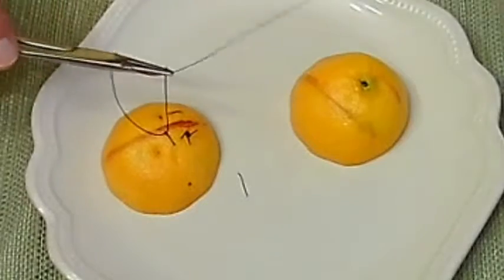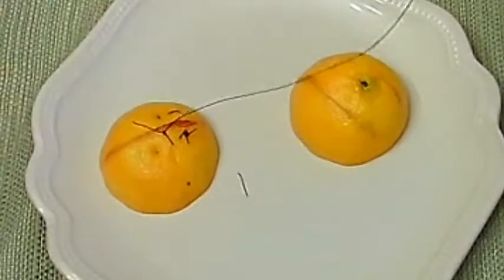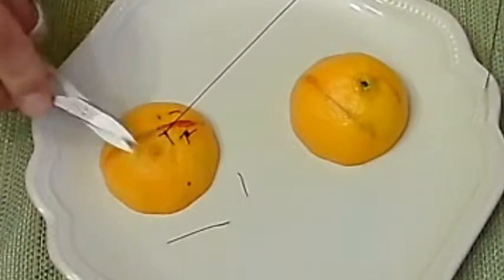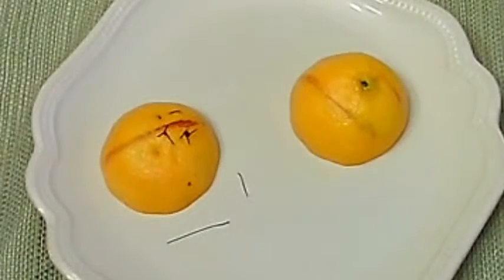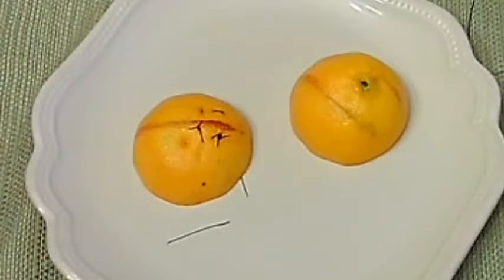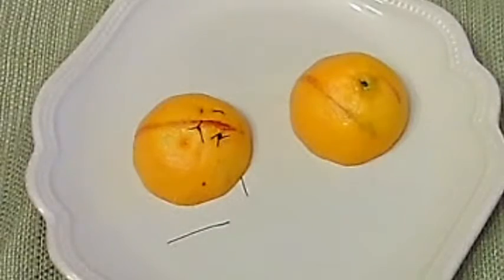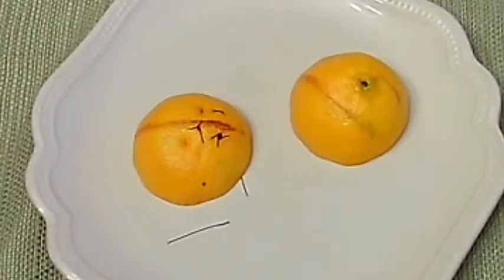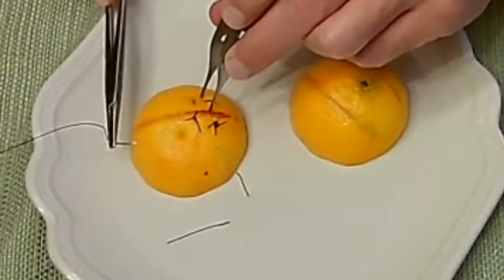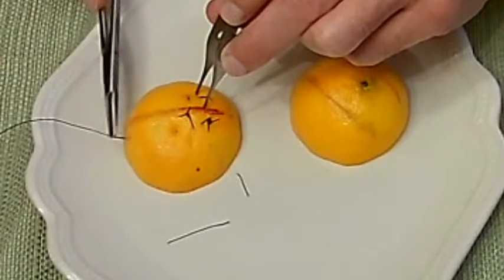It's very hard to go wrong with a vertical mattress suture. It's tedious to put in — it requires a lot of throws and it's not a running suture, so it takes a long time. But it's the crème de la crème of approximating skin. You can never go wrong with that. A little harder to remove, but sometimes those edges are not quite as exposed.